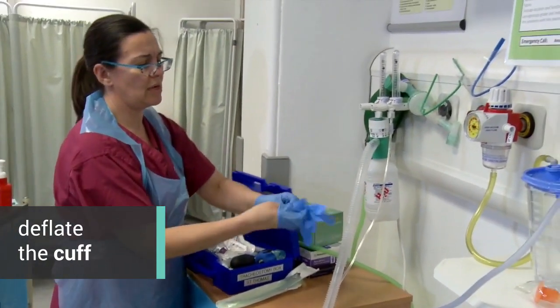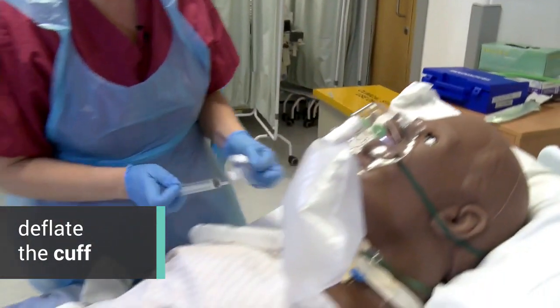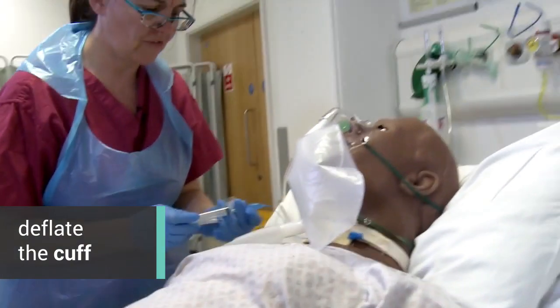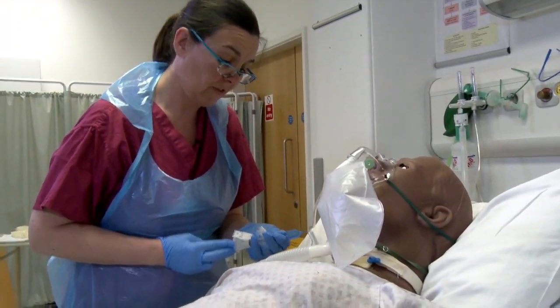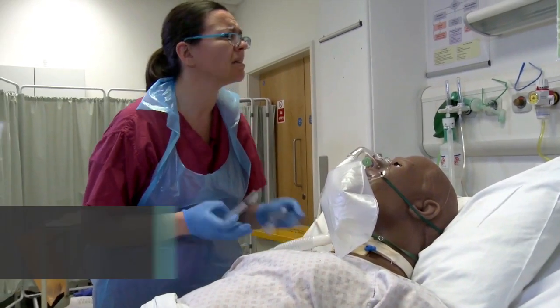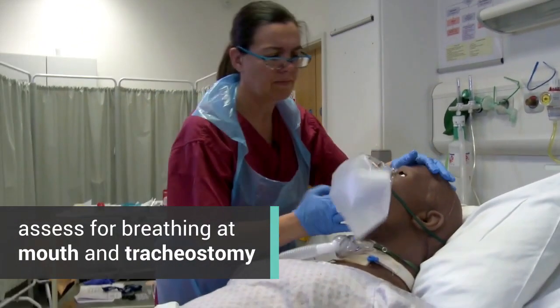Just try and keep breathing steadily for us, Robert. I'm just going to take the cuff down — it might make you cough a little there. Cuff's fully deflated. And then look, listen, and feel at both the mouth and at the tracheostomy site for any signs of breathing.